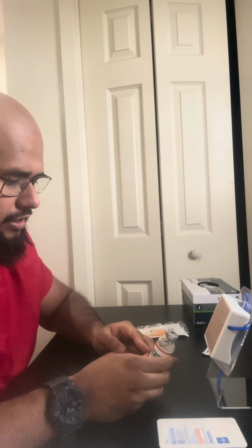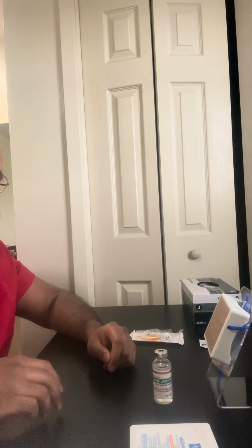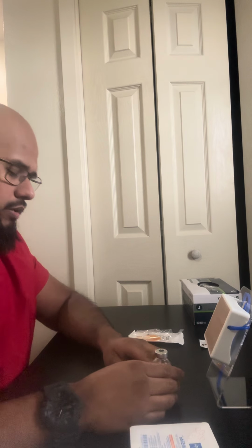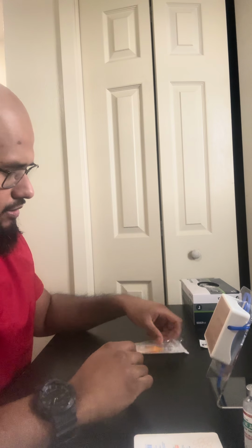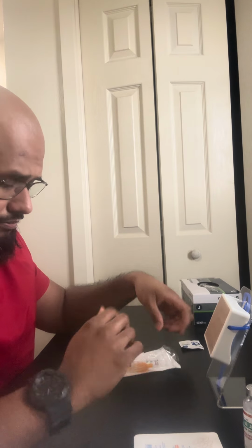I verified it three times already. If I were preparing this medication away from the bedside, when I draw it up I'll make sure I put a label on my syringe. But we're at the patient's bedside. We confirmed it's him. We looked at the MARS and the orders, and made sure we have the right drug, and we're ready now. I already cleaned the site, and the circular motion is already air dried.